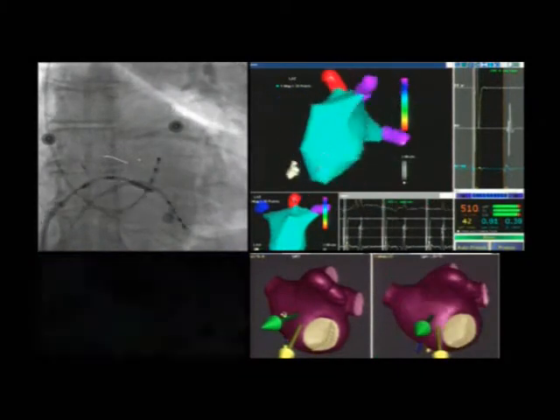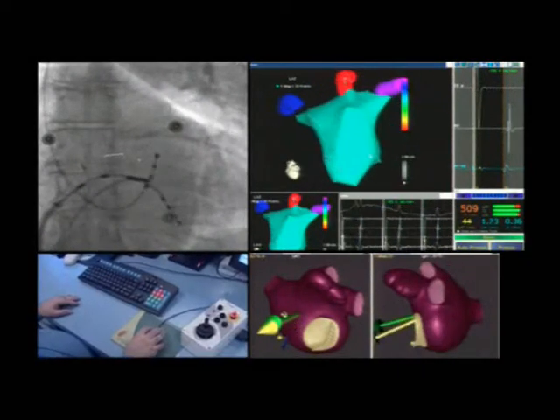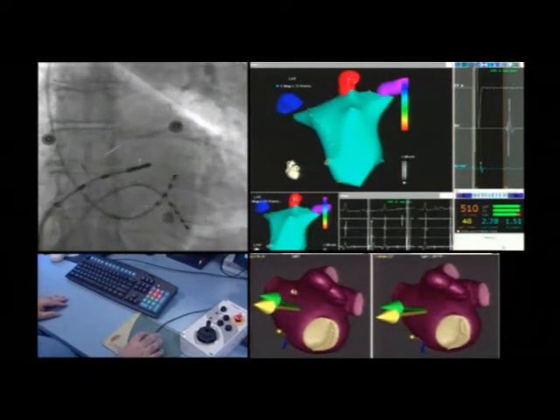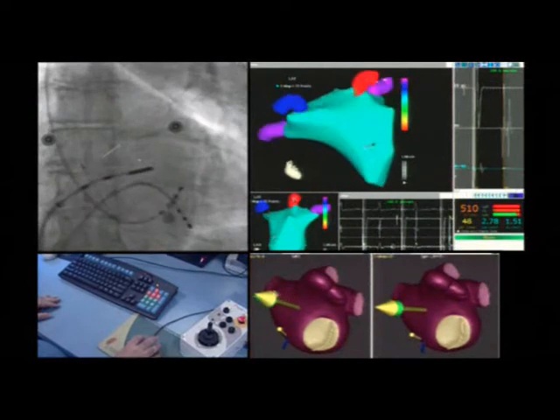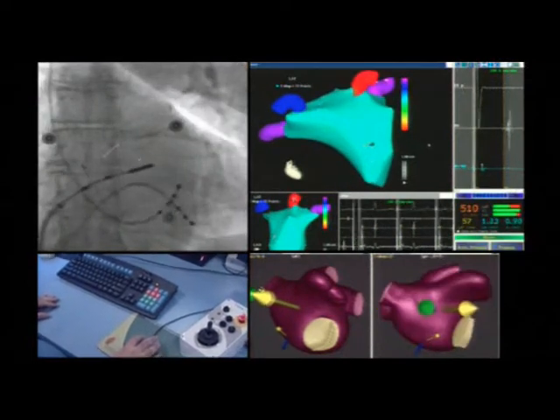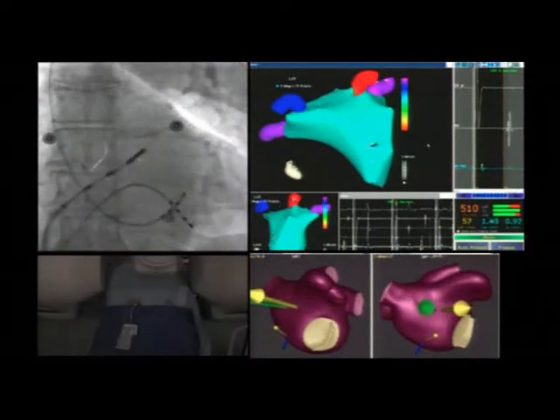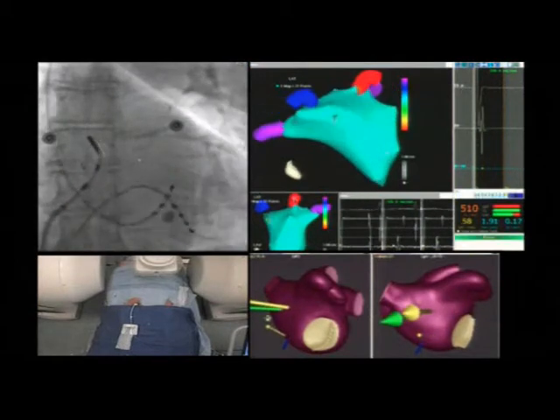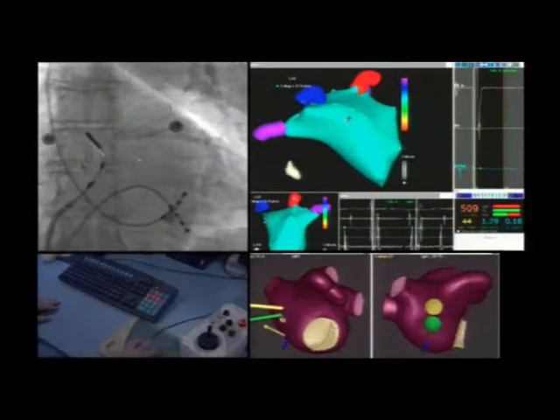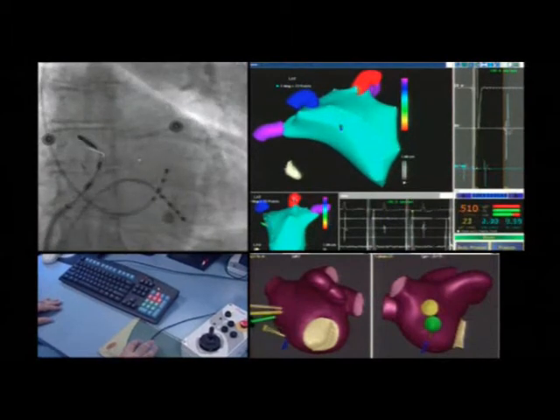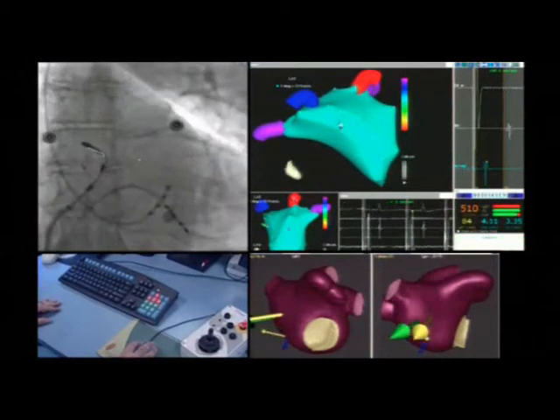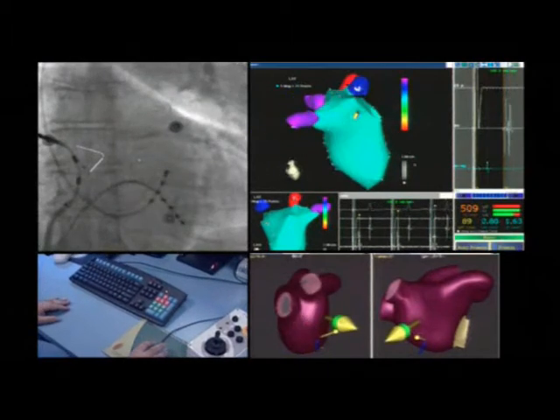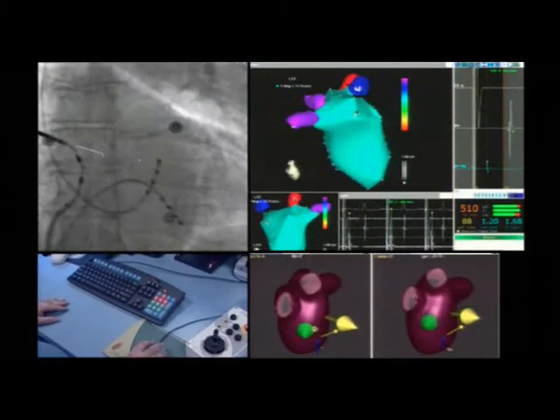The next region to be mapped is the septal area. The reconstruction of this area is difficult when using the standard manual approach. This problem can be overcome by the use of the magnetic catheter, which being adherent allows very rapid acquisition of several points, giving the possibility of an accurate reconstruction of this region.